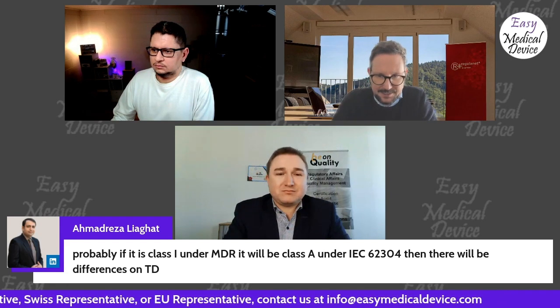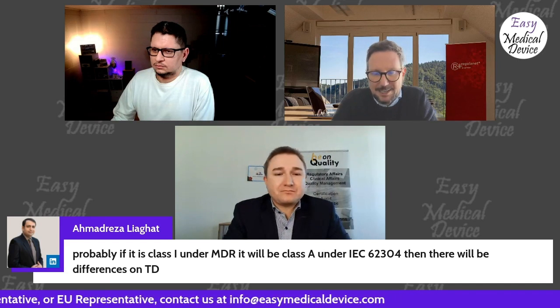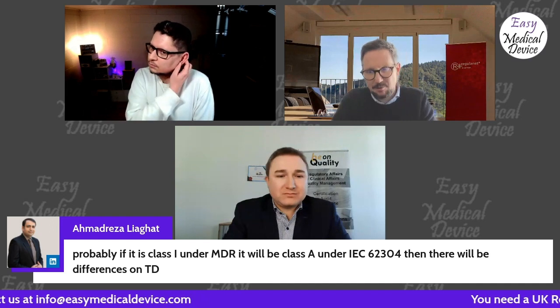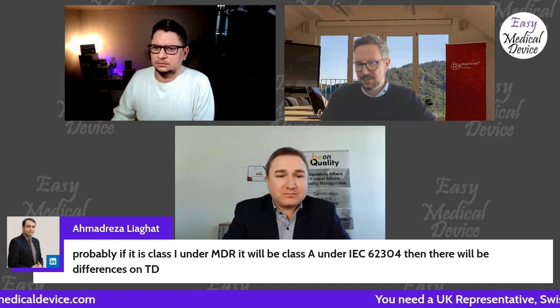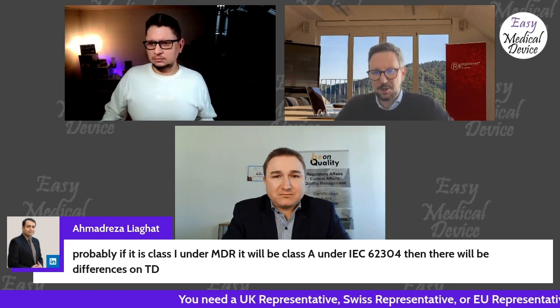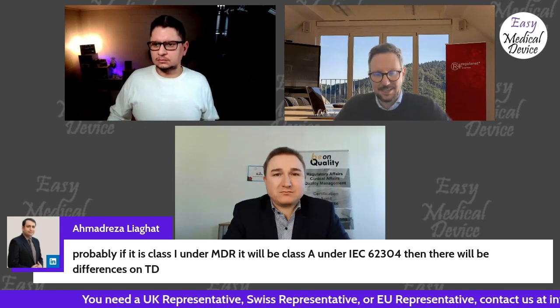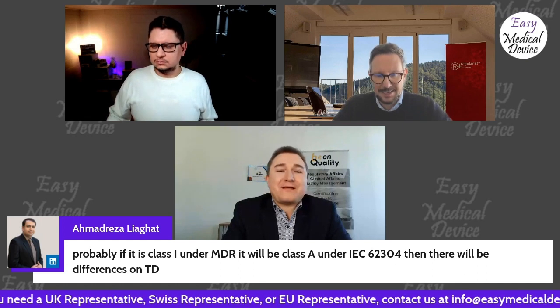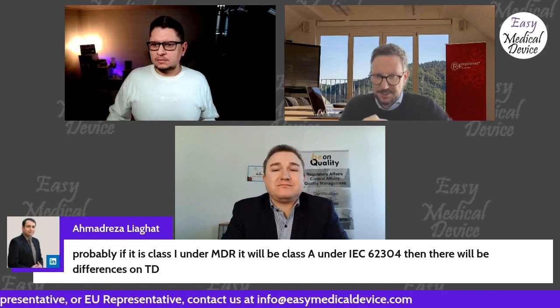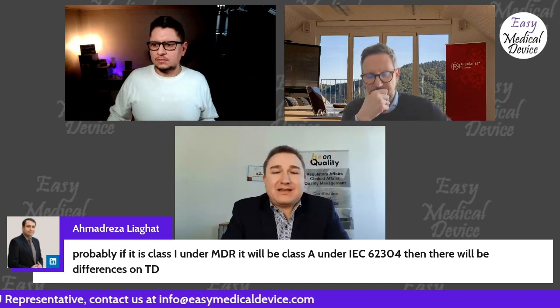And therefore, I always try to distinguish here. I mean, the other way around, for example, you can have a class 3 product, but it doesn't necessarily mean that all of your software in it is class C. It can also be class A, depending on what mitigations you have on top of it. So the other way around, distinguish, Stefan. Do you have something in mind?